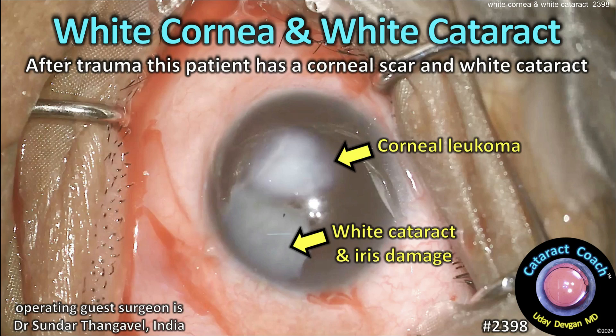CataractCoach.com — white cornea and a white cataract. After trauma, this patient has a corneal scar and a white cataract.